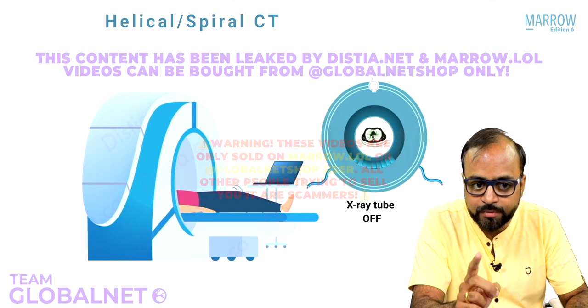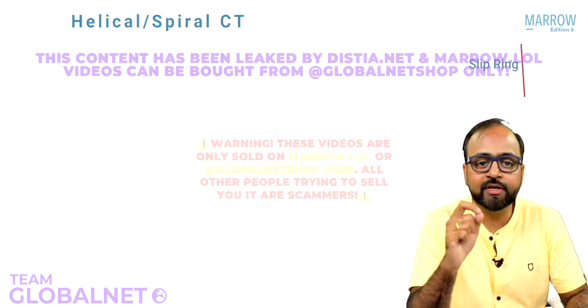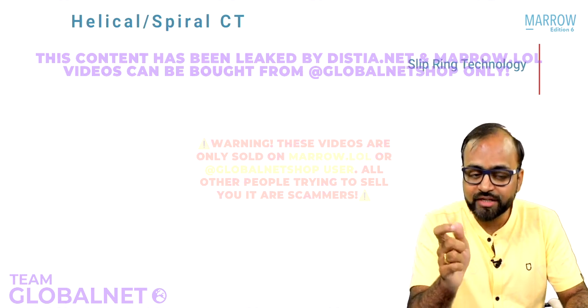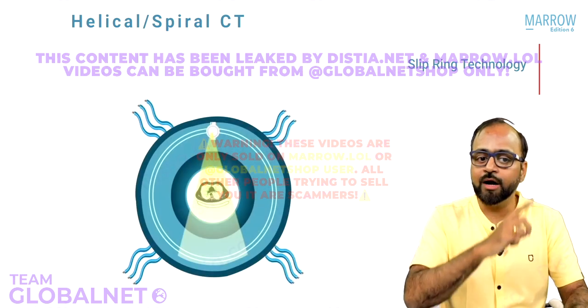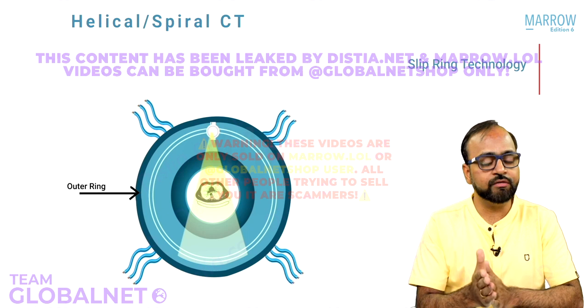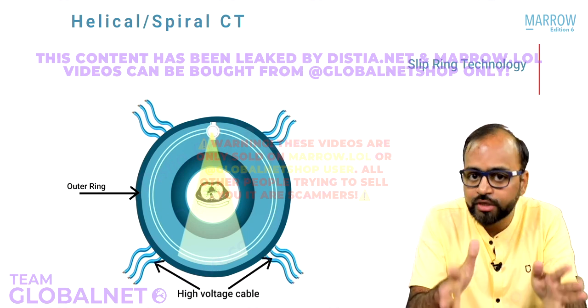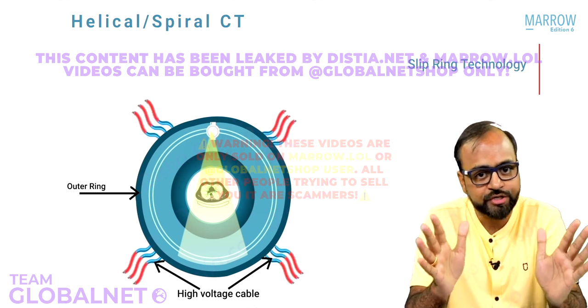This was made possible by the introduction of a technology called slip ring technology. Look at the name. There are two rings that are going to slip over one another. So how does it work? See, there is an outer ring which is completely stationary, and all high voltage cables are attached to the outer ring, right? It is not going to move, so no tension at all, no short circuit or stretching of wires.